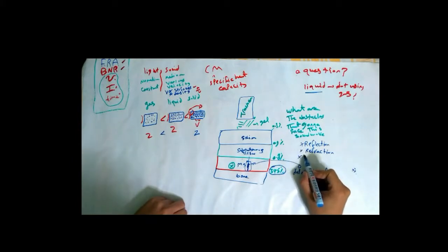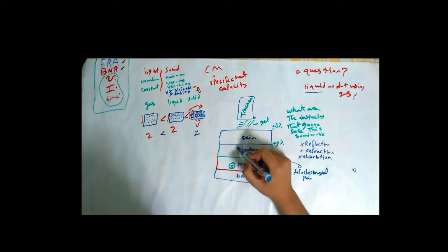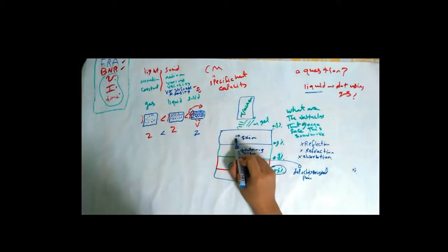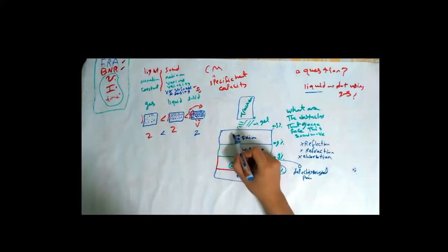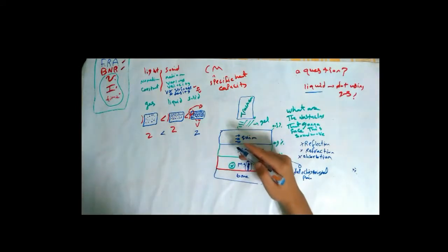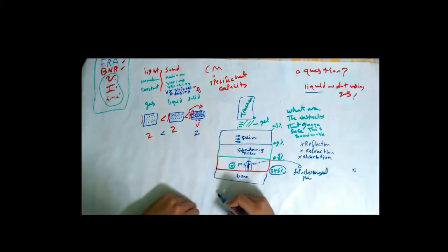The final problem is absorption. Absorption means that when sound waves are propagating through a medium, for example skin and subcutaneous tissue to reach the muscle, some of its energy will be absorbed by the skin and will not be transmitted to the next medium. It's also the case with subcutaneous tissue. Each medium the sound wave propagates through will cause absorption.